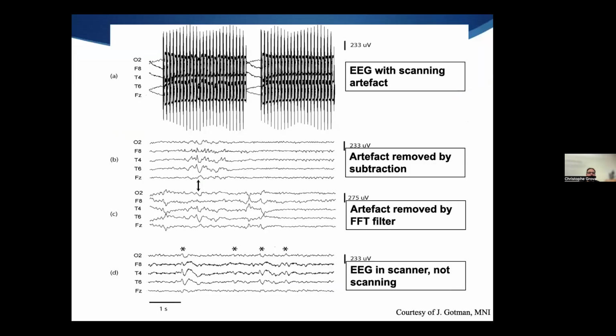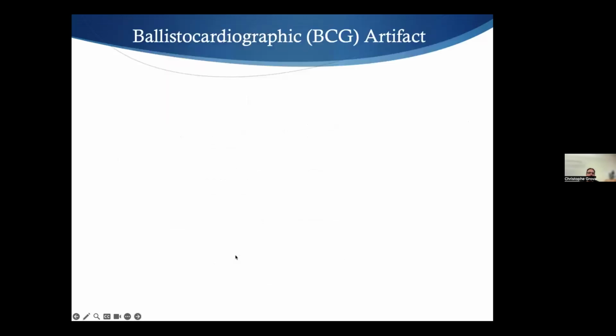After correction of the ballistocardiogram, it is better, but still probably not perfect. I have a few examples here. This is just another example, EEG with artifact after subtraction. At the very beginning, some techniques used some filtering in Fourier, but that was not perfect because the bands covered by the gradient artifact are narrow, but not so narrow. And this is also the EEG in the scanner when it's not scanning, which is a good tool to use because it's not so bad, but you still have the ballistocardiogram.